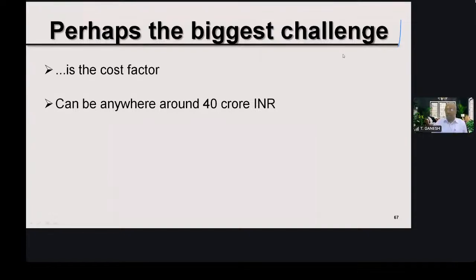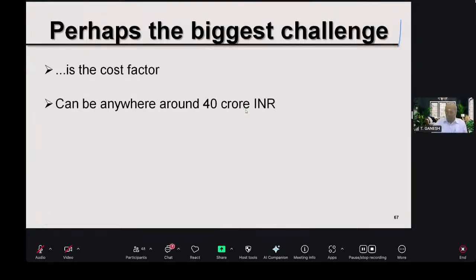Perhaps the biggest challenge, why we are not seeing this photon counting CT in routine use in clinic, I think, is the cost factor. It can be anywhere around 40 crores Indian rupees, maybe more than that.